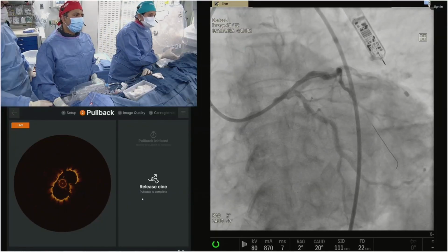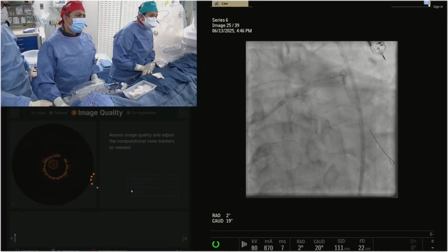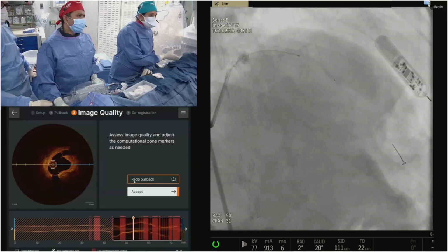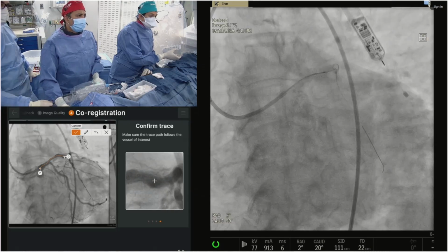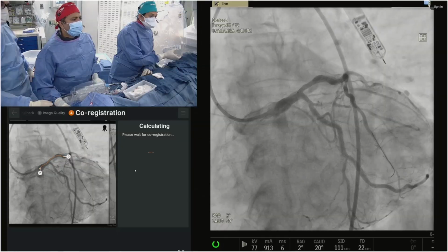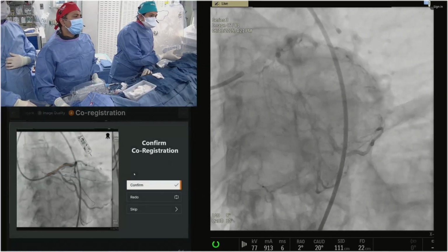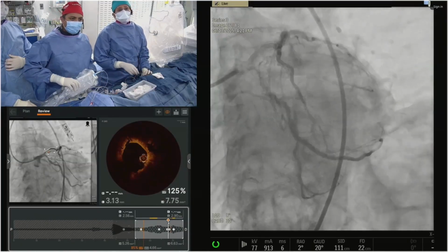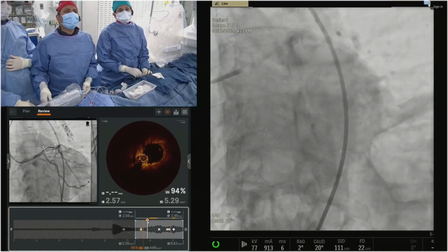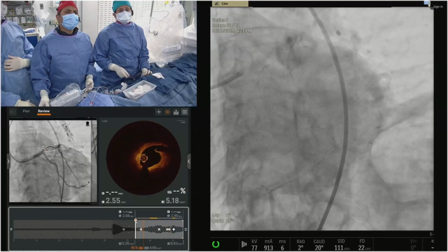Contained perforation? Forget it, I know, contained perforation. It's a deep wall dissection. So it was lipid rich. The cutting was too much. I would go with a papyrus up front. No. What do you see? Okay. Oh, deep cuts. A lot of plaque modification. Yeah, a lot of dissection.